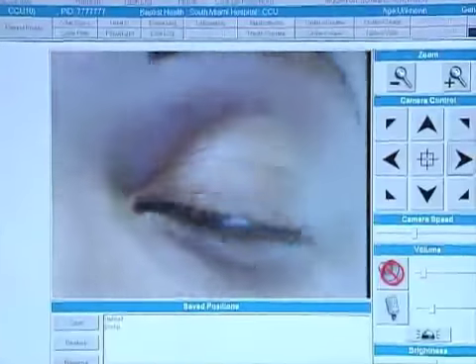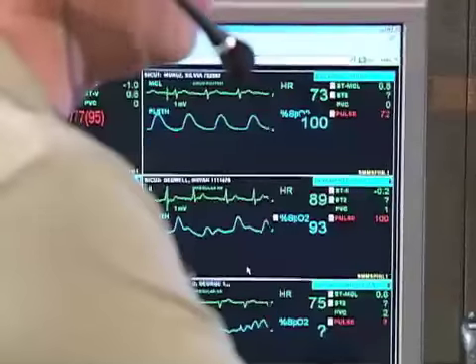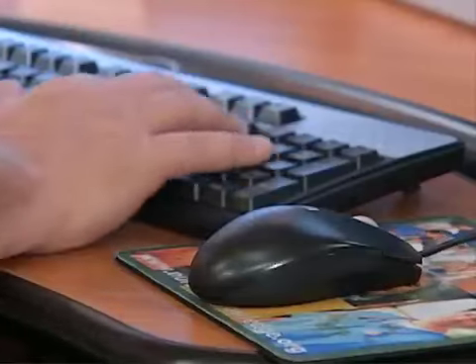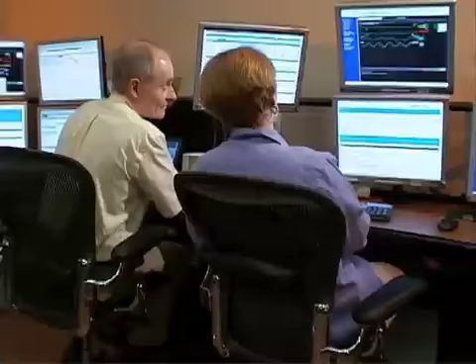Should a patient's condition become unstable, the off-site team receives smart alerts indicating changes in status. The alerts trigger consultation between off-site and bedside members of the critical care team. When the attending physician is not immediately available, the off-site physician orders life-saving intervention. The patient's private physician, or even the in-house physicians, is not at the bedside all the time. However, using the software and the programs available in the eICU, the physician is able to be essentially at the bedside all the time. We're able to track the patient's physiology and to be present quicker and sooner than the private physician in the case of an emergency.